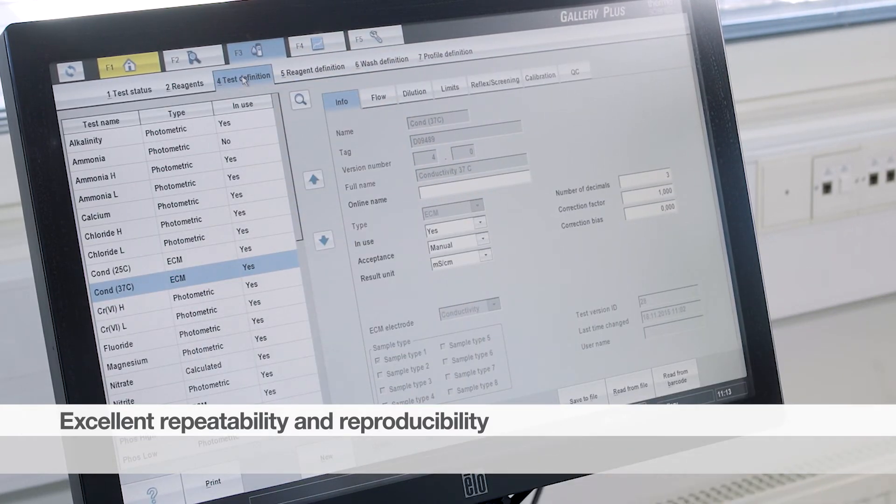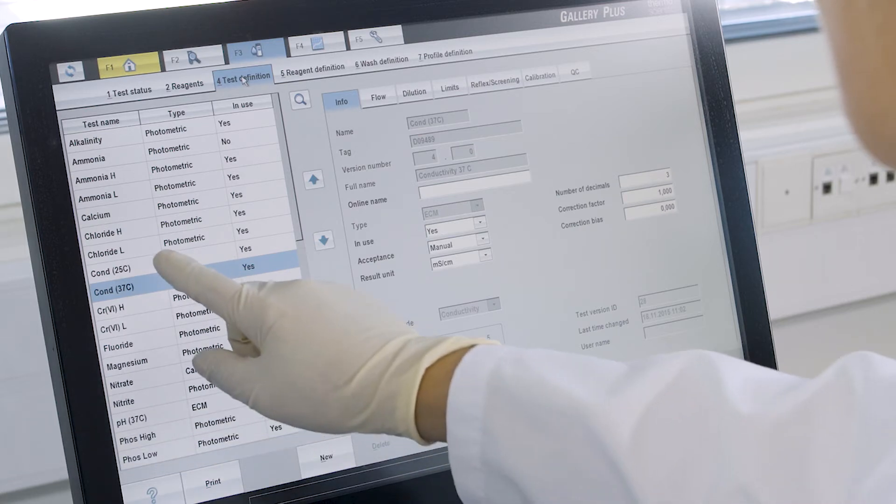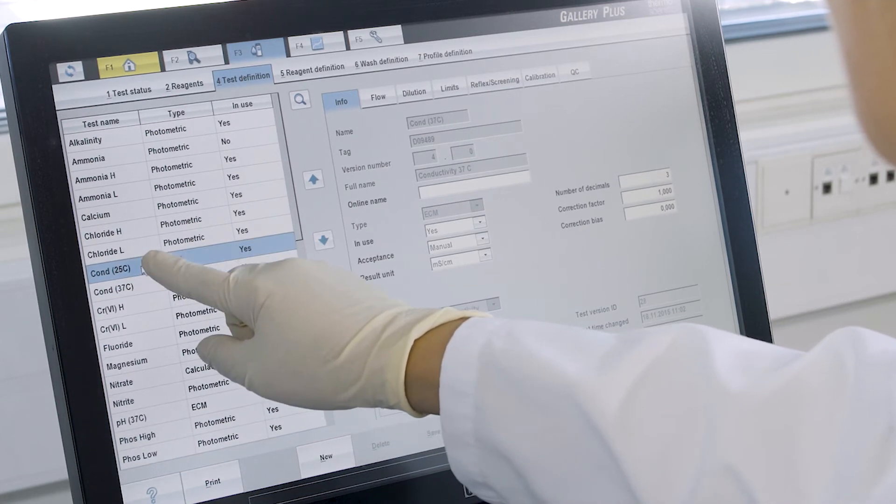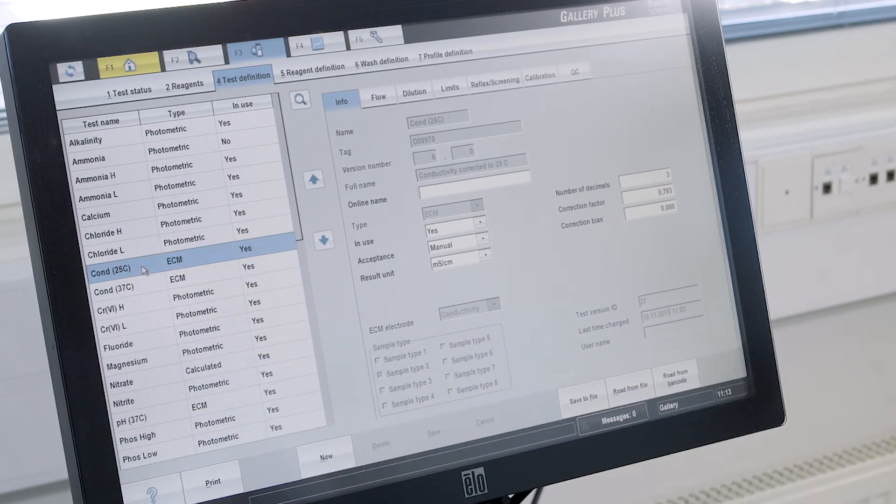The ECM unit is suitable for many kinds of enzymes, food, beverage, and water samples.